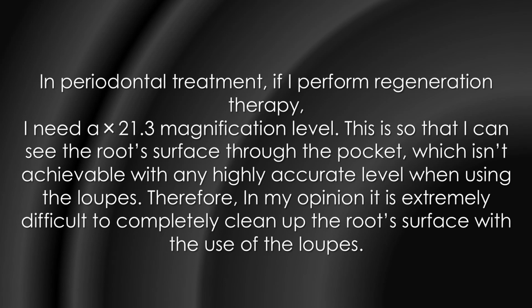In periodontal treatment, if I perform regeneration therapy, I need a 21.3 magnification level. This is so that I can see the root's surface through the pocket, which isn't achievable with any highly accurate level when using the loupes. Therefore, in my opinion, it is extremely difficult to completely clean up the root surface with the use of the loupes.